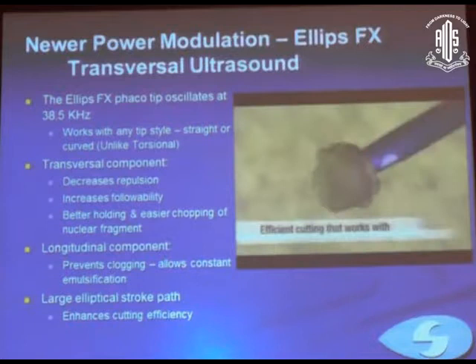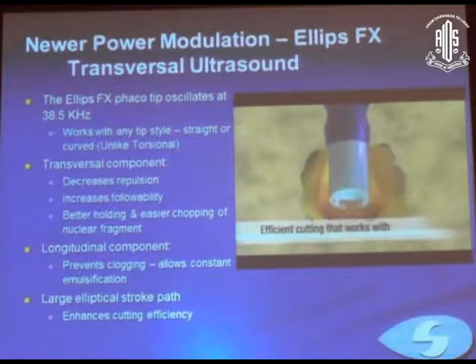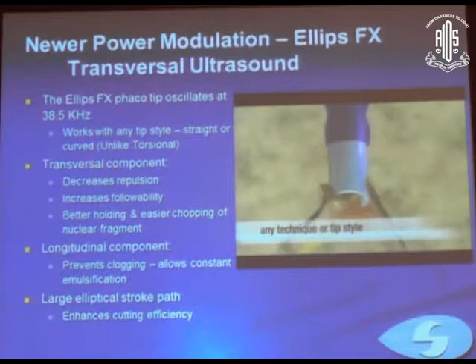The transversal component decreases the repulsion, increases the followability and stability, gives better holding and makes chopping of nuclear fragments easier. So that is what the transversal component does. The longitudinal component prevents clogging and allows constant emulsification. And the combination of the two, that is the longitudinal and the transverse component, leads to an elliptical path which enhances cutting efficiency.